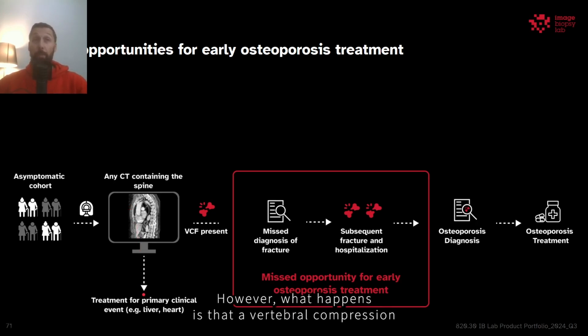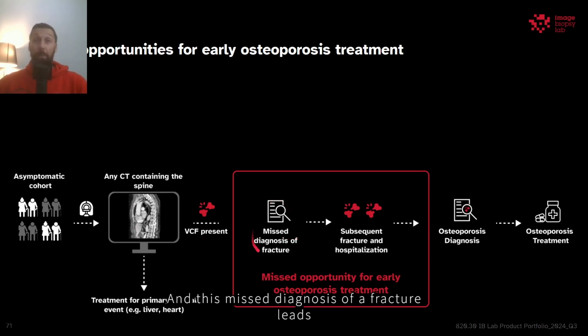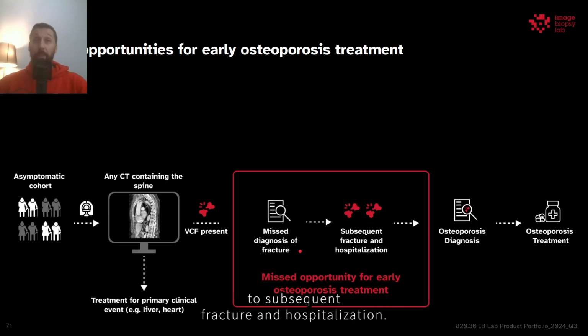However, what happens is that a vertebral compression fracture is present, however missed. And this missed diagnosis of a fracture leads to subsequent fracture and hospitalization.